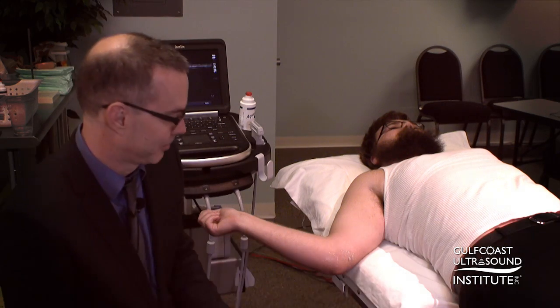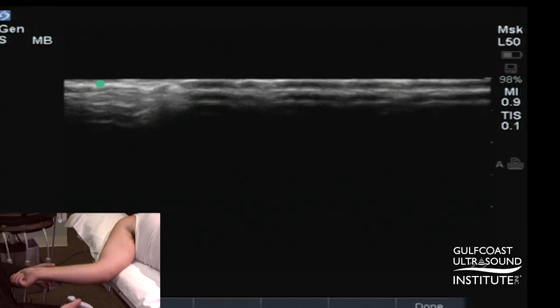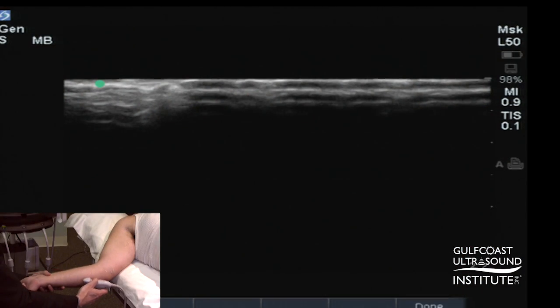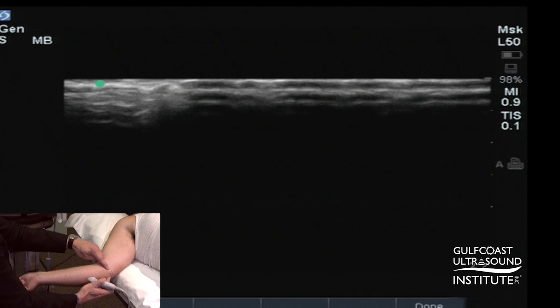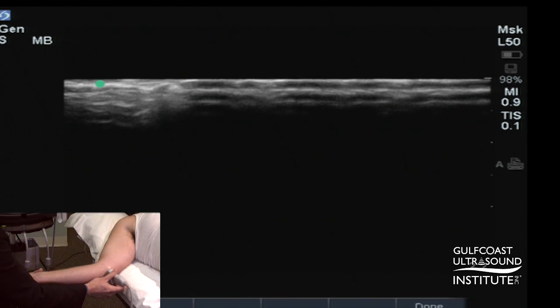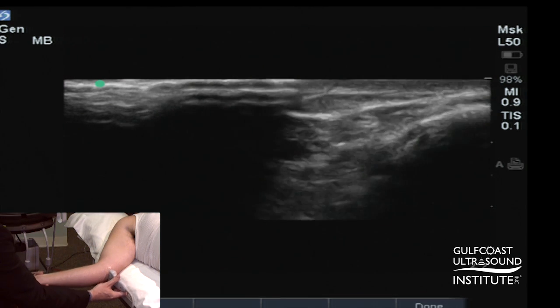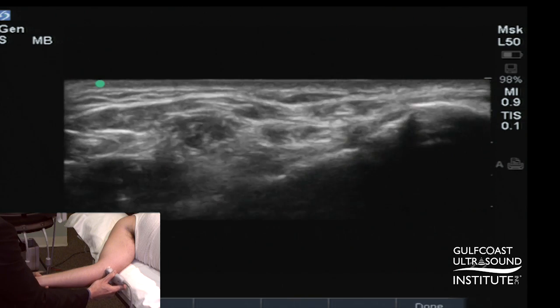Hi, my name is John Jacobson and I'll be demonstrating ultrasound of the cubital tunnel. To begin, I have the elbow extended. I'm using two palpable landmarks for orientation: the medial epicondyle of the humerus and the olecranon process. If you connect these two landmarks with the transducer, this will give you an axial plane of the cubital tunnel region and the ulnar nerve.